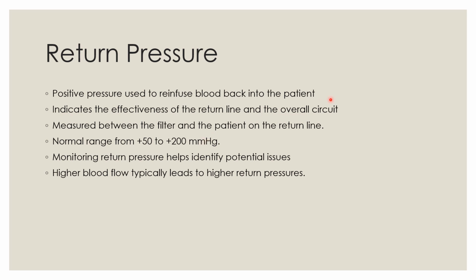Monitoring return pressure helps identify potential issues like kinks or blockage, as a high return pressure could indicate a kink in the return line or blockage in the catheter. A sudden drop in return pressure could signal a disconnection of the return line. Higher blood flow typically leads to higher return pressure.